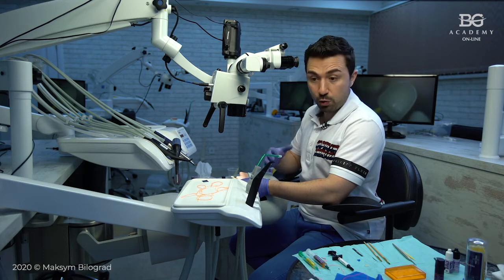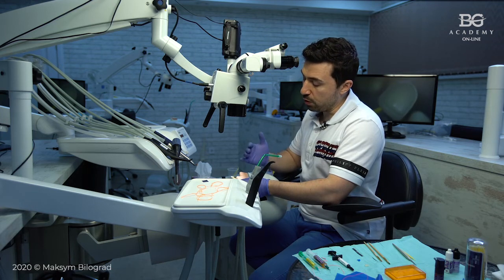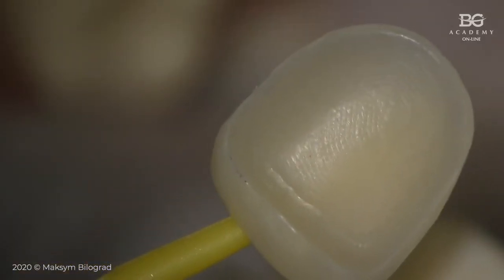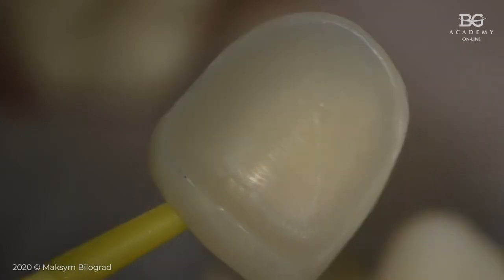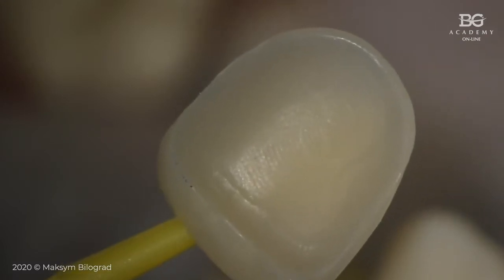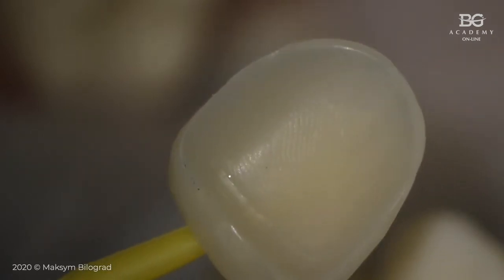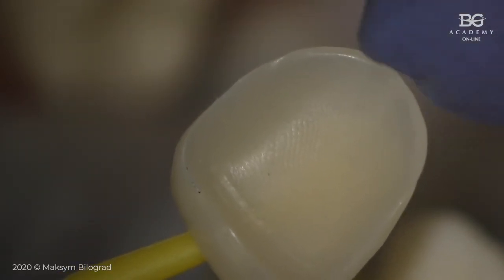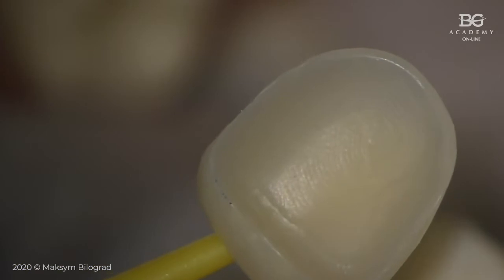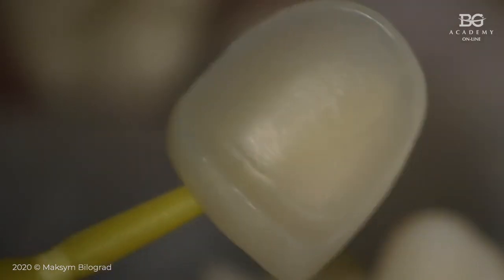And if the fit of your veneer was good and you have this brown line, it says that you have problems with glazing. So you have to be really aware of glazing, okay? And you have to see that there is no glaze. If there is glaze, what do you have to do? In this case, you may take a red diamond at low speed, no water, with a very stabilized burr in a handpiece. You have to remove glaze from the internal veneer surface, and only after that can you etch with hydrofluoric acid.